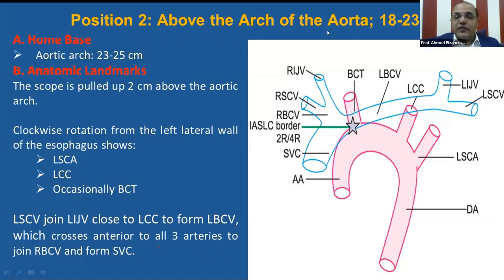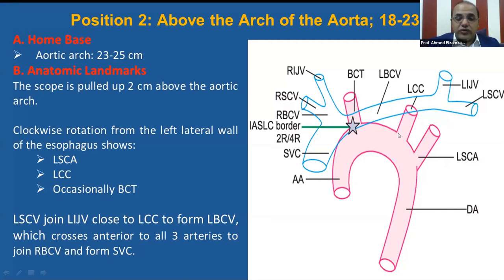Position 2 is above the arch of aorta, from 18 to 23 centimeters. The home base is the arch of aorta. The scope is pulled up two centimeters above the aortic arch, then clockwise rotation from the left lateral wall of the esophagus. This is the left subclavian artery, then with further clockwise rotation we get the left common carotid artery. The left subclavian vein joins the left internal jugular vein to form the venous confluence and form the left brachiocephalic vein near the left common carotid artery. The left brachiocephalic vein crosses the three main arteries above the arch of aorta to join the right brachiocephalic vein and form the superior vena cava.